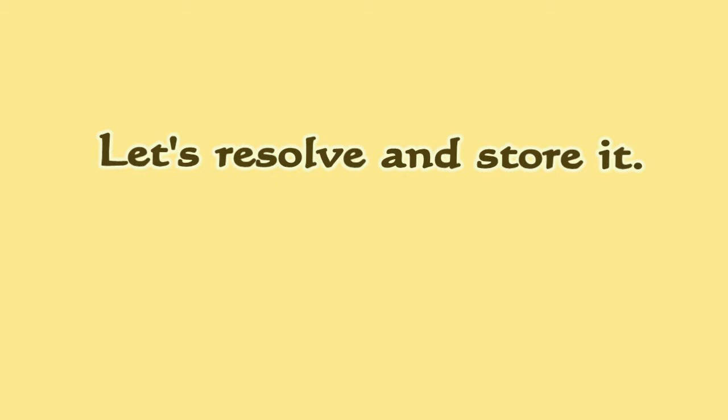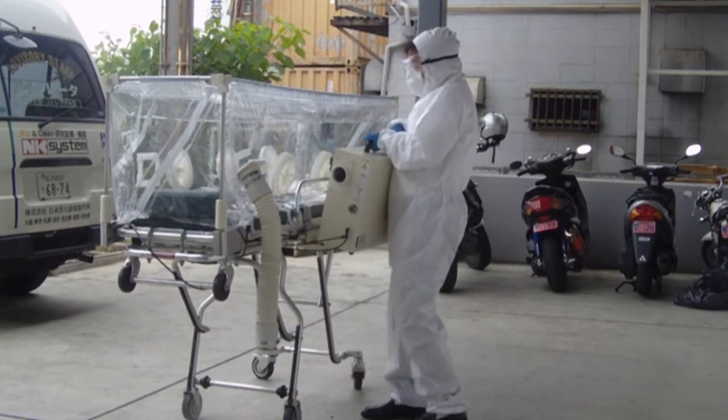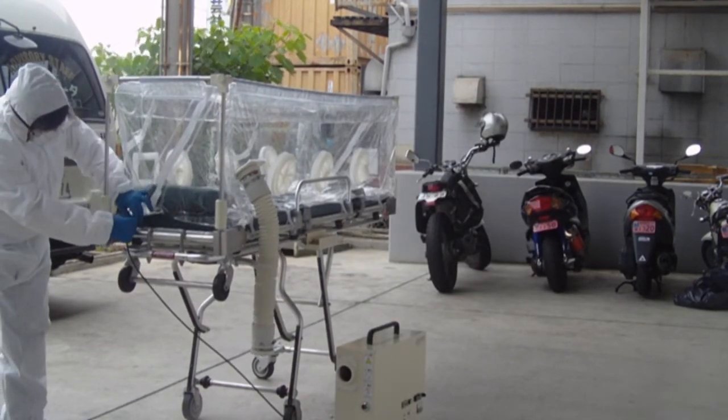Let's disassemble and store it. The air tube and exhaust hose are removed. The electrical fan box and vinyl capsule are detached.